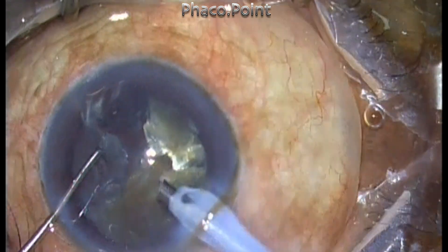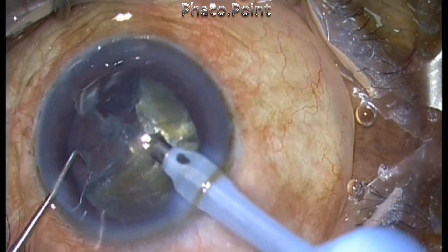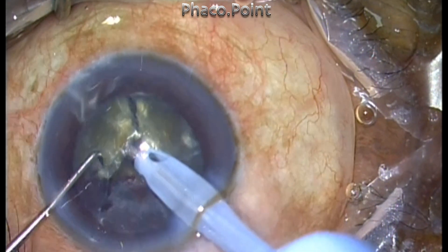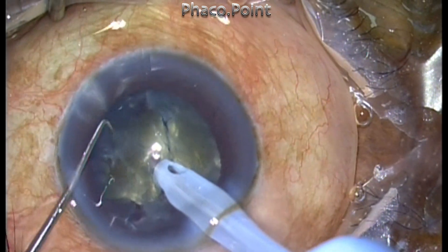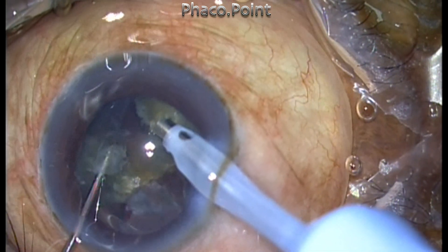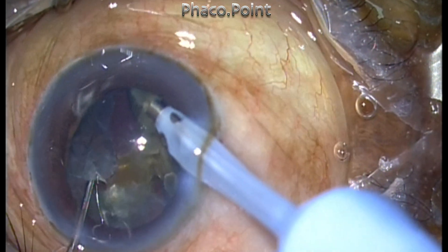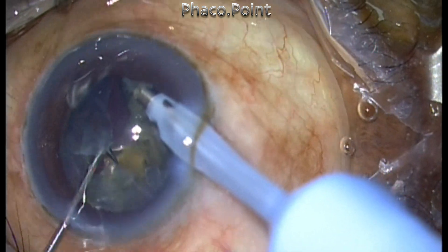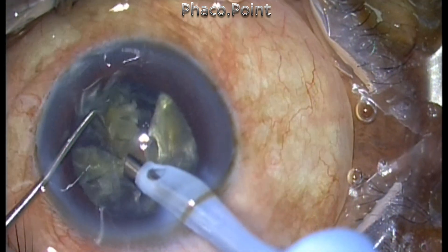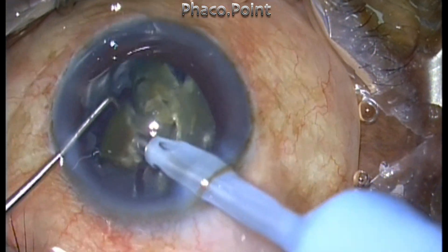Each of the four quadrants you create is then broken up further into smaller pieces. Downsize each of the four fragments, create the fragment, make sure you have achieved lateral separation, and confirm the piece is free from the surrounding nucleus. Only when the fragment is completely free do you mobilize and address it — one at a time.